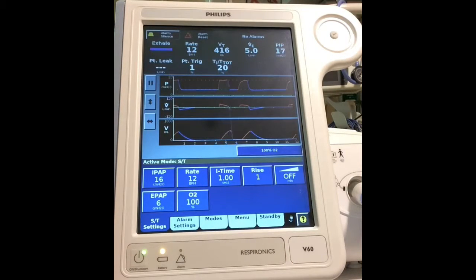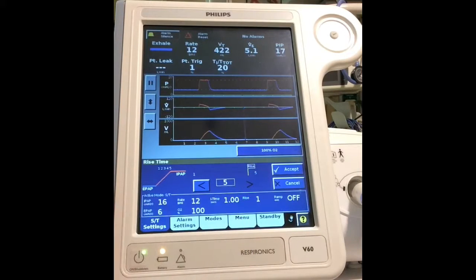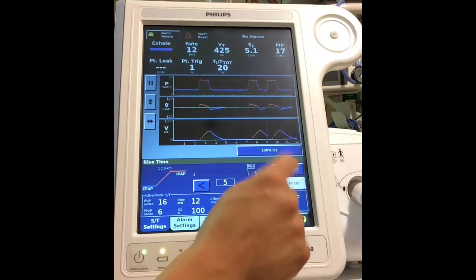Two things usually happen. Either that patient feels very comfortable that they're getting that really fast breath in, or they're going to say it's way too fast and it's actually harder to breathe. If you have that patient that says that's uncomfortable, I do not like that, turn it all the way to a 5. That's a nice slow breath in.